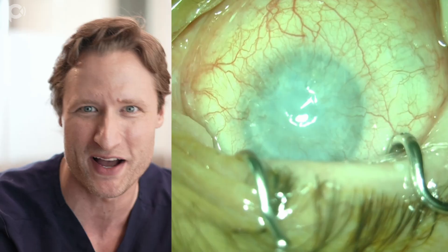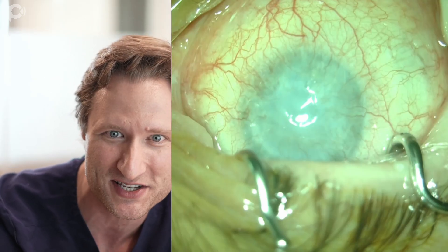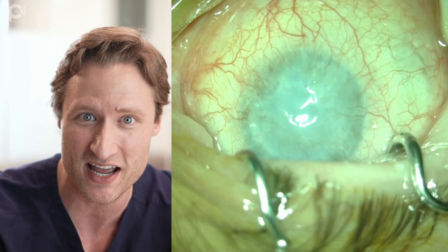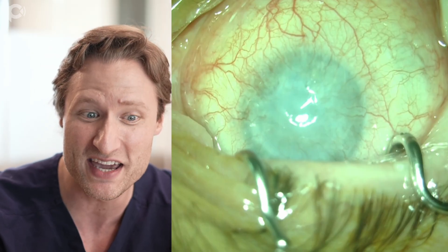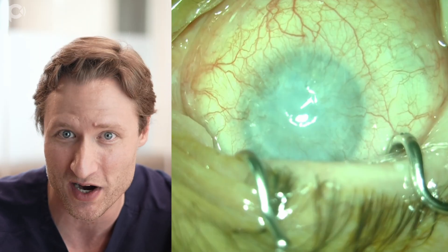Let me tell you about this patient. This is his only eye. He's got a prosthesis in the other eye, and this eye has a long-standing failed PK, which as you can see is opaque and densely vascularized.